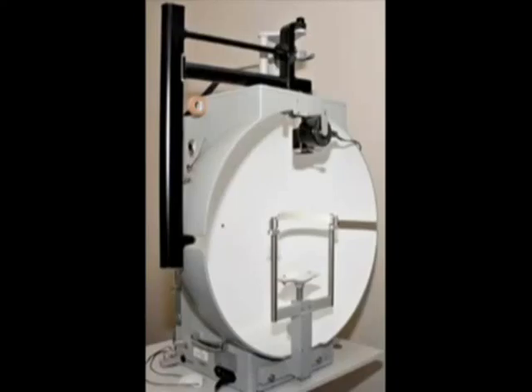Here is a normal Humphrey field, and here is an arcuate defect in glaucoma. This is termed static threshold perimetry, as the stimuli are shown in fixed grid positions to establish the threshold at each point. In contrast, the Goldmann field is kinetic threshold perimetry, where the light stimulus is moved in towards the centre of the vision until it is detected. The patient again fixes the tested eye upon the central light target, while this time an examiner manually brings lights towards the centre of vision until it is detected.